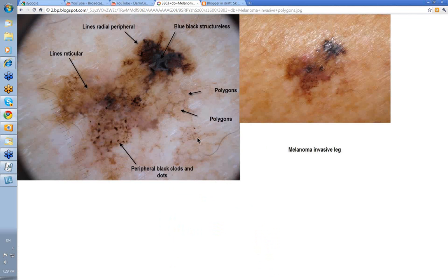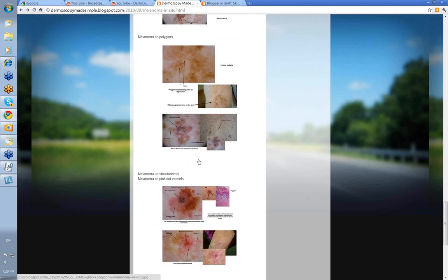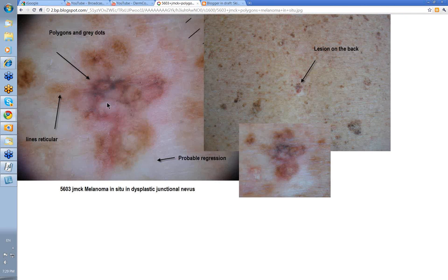Melanoma with peripheral black dots or clods. Mainly clods peripheral, some black dots as well. Lots of other features in here — even some polygons in this particular melanoma. Clinically, look at the varying pigmentation — always a melanoma. This is another one with polygons here, again grey dots, some polygons. This is the lesion in amongst all these SEBKs. This is probably a bit of regression — this pallor that we're seeing down here. Again a bit of lines reticular.